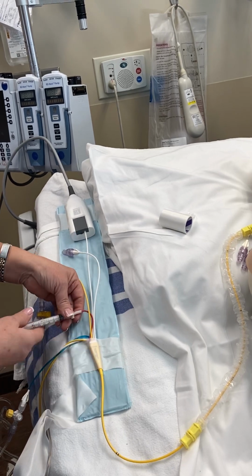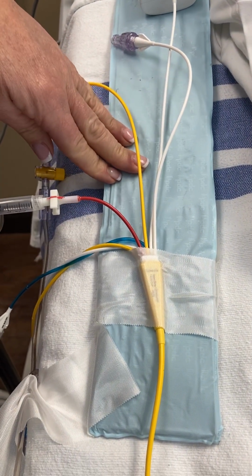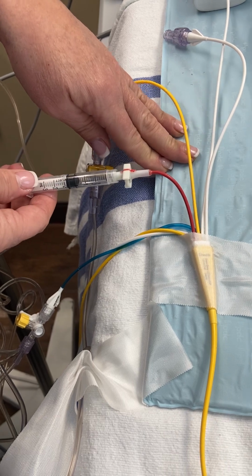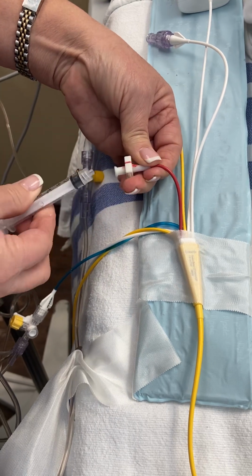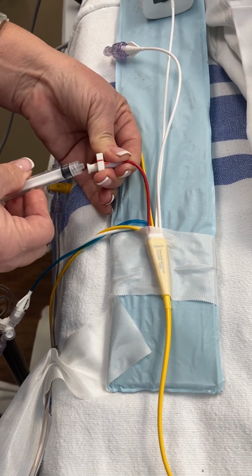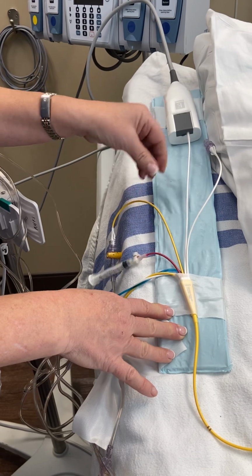As a safety thing too, let me remind you, a lot of times this is the way the patient will come back from the OR with the syringe on your wedge like this. Keep in mind too, this is a specific syringe. You cannot just put a regular 3cc syringe on this Swan. So as a safety thing, what I do is I will close it off to the patient, take my syringe off, take the air out, put it back on, open it back up to my syringe, pull negative pressure, and then close it, take my syringe back off, and take the air out. Just as a safety measure. You don't want the balloon to accidentally become inflated if the patient rolled over on your Swan or what have you. So that's just a safety thing and protects the patient.